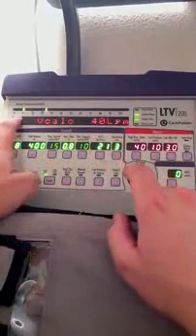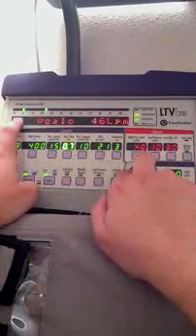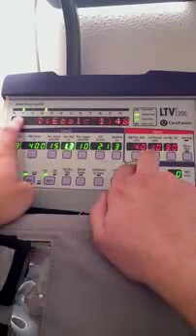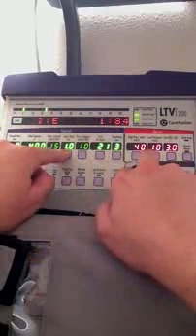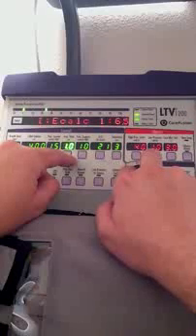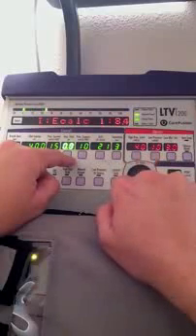You'll also notice that that changes your I:E ratio. So we'll scroll through and take a look at our I:E ratio now, 1 to 6.5. What I can do is increase the inspiratory time. That'll decrease the flow, and now I have an I:E ratio of 1 to 4.8. But if I decrease it again, you can see that my I:E ratio goes back to 1 to 6.5. If I decrease the I time, of course, I'm going to have a longer ratio. Increase the I time, a shorter ratio. We'll go ahead and set it back down at 0.8 seconds.